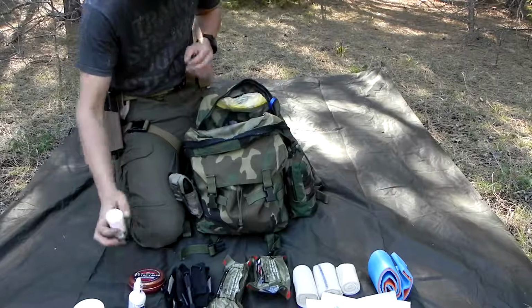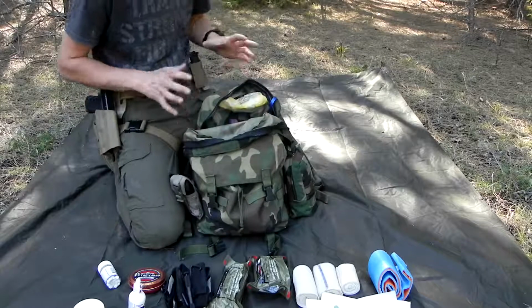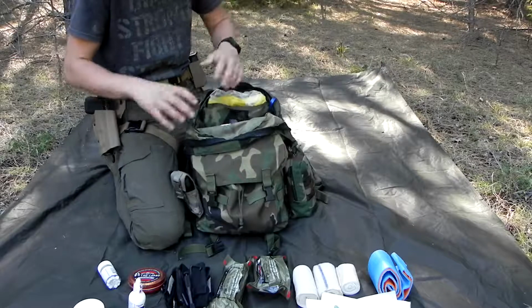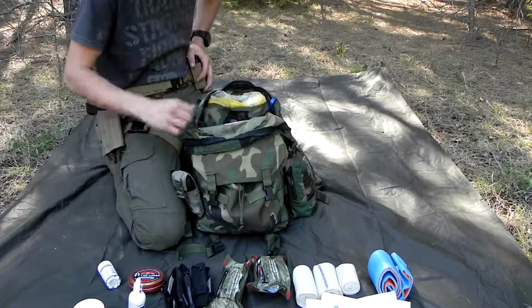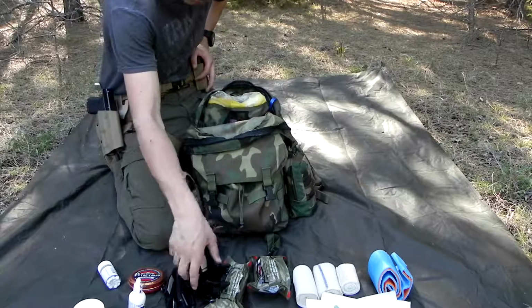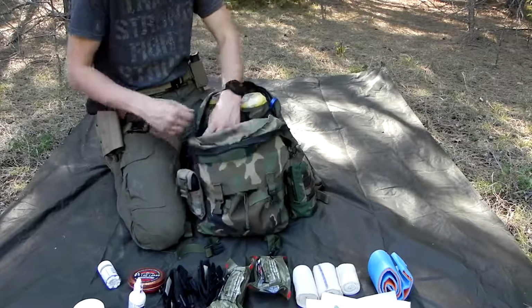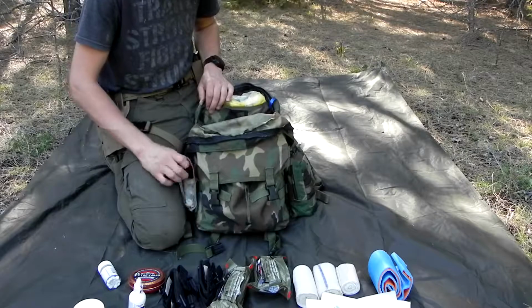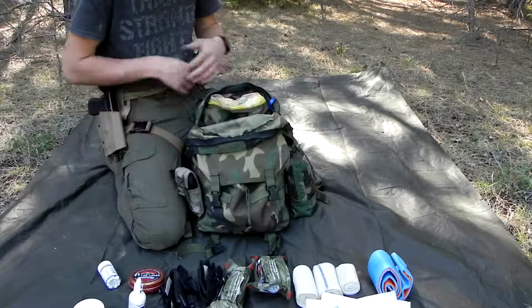I don't remember if I have bought any yet. I have a list of a couple more things I need to get for this bag. So this isn't always adding and learning how to use more of this equipment, and adding new stuff that might be better than some of the older stuff I have. Like these tourniquets are an older tourniquet. They're brand new, never been used, but I could buy newer Gen 7s like I have on the outside here. This is actually, I think, a 2nd or 3rd generation tourniquet. It's like one of the first ones they made.